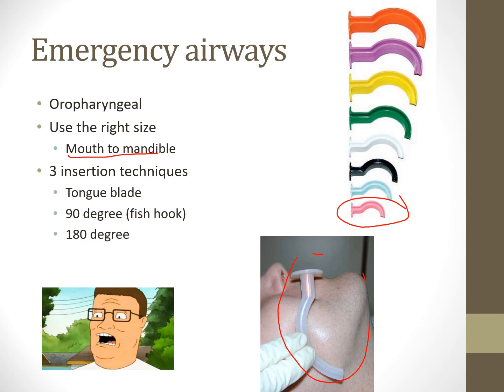There are 3 insertion techniques for this. There's the tongue blade. So the tongue blade says, hey, you're just going to use that long popsicle stick thing, put it into the oropharynx, put pressure on it going outward, right? Going this way. And then you're just going to insert it naturally like that, with its natural curvature.